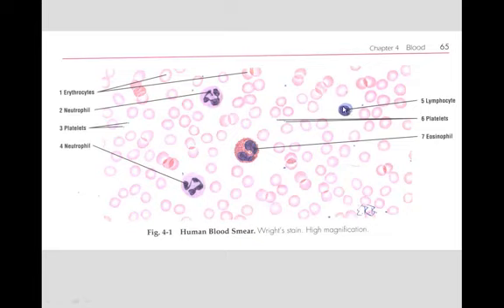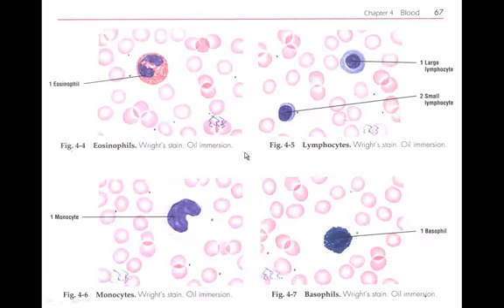Another popular cell is a lymphocyte, which mostly looks spherical with a little bit of cytoplasm around it. Also, we see an eosinophil, which is similar to the neutrophil, other than it has eosinophilic granules. In contrast to the eosinophil, we see the basophil. The basophil has very large blue granules, kind of like the eosinophil, but blue. Also it's hard to see the nucleus of a basophil because the granules do not lay to the side as they do in the eosinophil. The granules are actually above the nucleus, impeding a clear view of the nucleus.